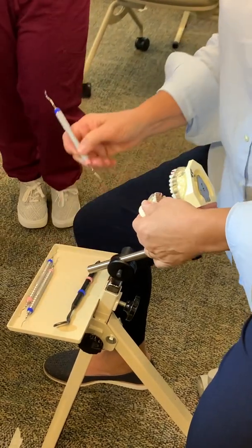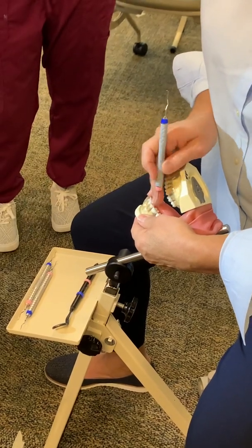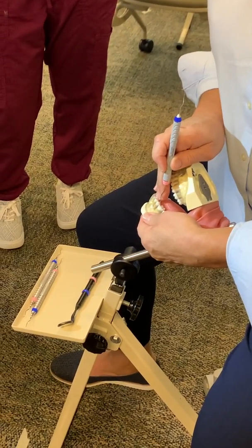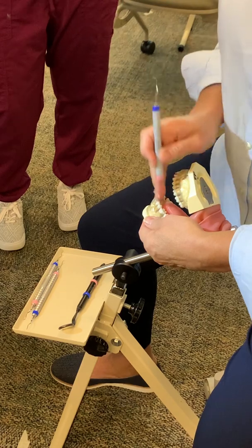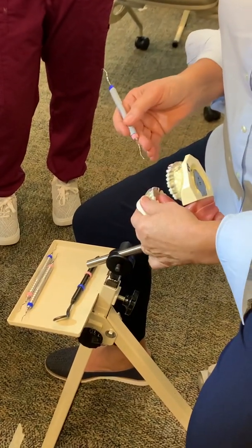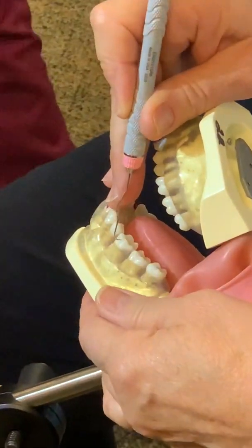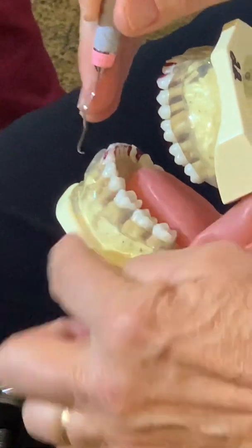And in testing too. If your hands are short, and mine are long, so I can get here and I can get over the top and reach my fulcrum. If you can't, your fulcrum keeps lifting off, then close the mouth a little bit, right? So coming over here. Now, if you've played with this, I'm going to demonstrate on the first molar here.